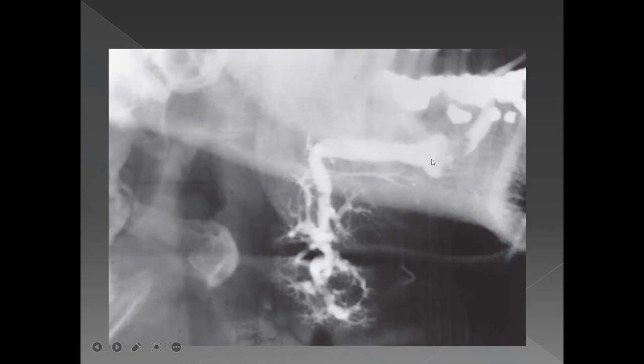But don't you see that the contrast agent is coming here? You have this break in the contrast, and then you have this enlargement of the gland and the duct of the gland, and then the contrast is continuing again. So this is basically a stone in the submandibular gland. Because of the stone, the gland will not allow contrast to pass very easily through this area, so that area will look devoid of contrast.